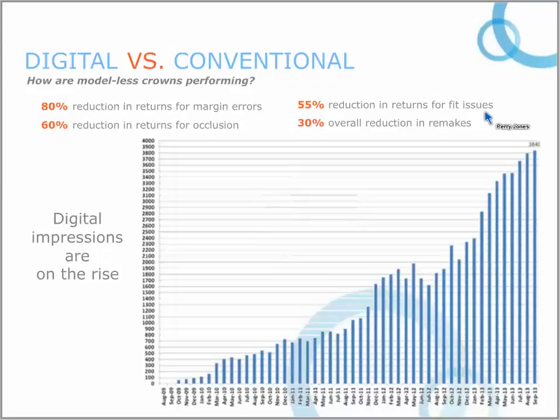That's pretty amazing stuff. If you'll look on the screen, what we learned from this graph is that from the get-go, which was about October of '09, you can see there's been a continuous trend in an increase in Glidewell, the lab, doing workflow digital with digital impressions as opposed to conventional stone.